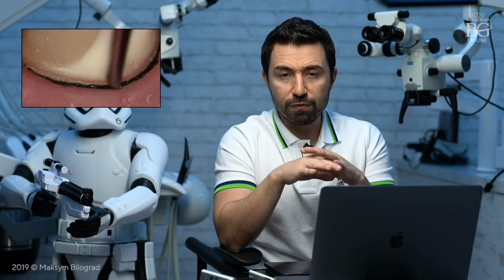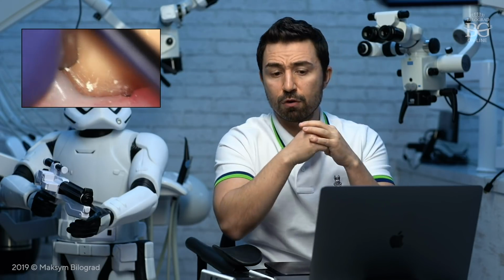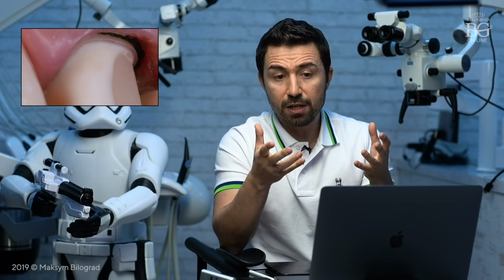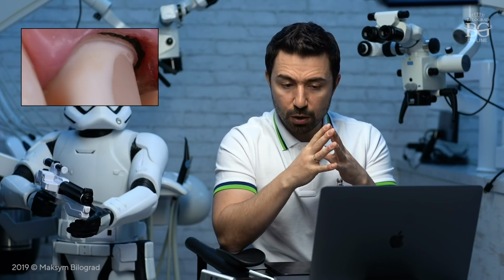So finally we finished the preparation with the rubber dam, then I removed the rubber dam. We wait 5-10 minutes just to give some time for the gingiva to go up. Then we placed retraction cords, and we finished our preparations without the rubber dam. The reason why we finished the preparation without the rubber dam is that we didn't see the level of the gum with it.